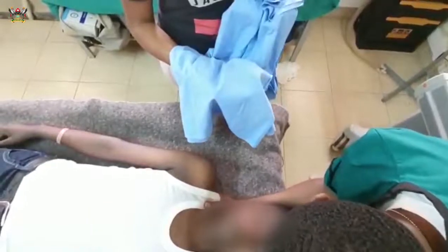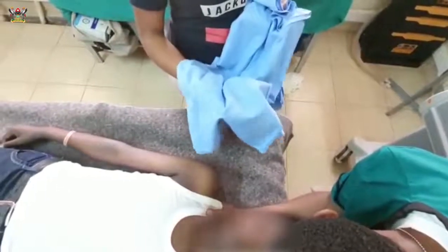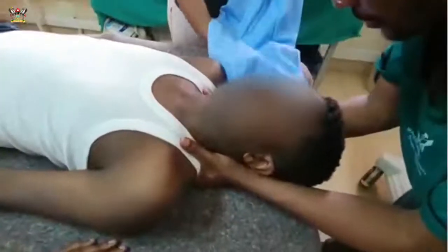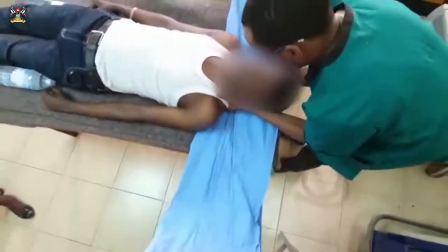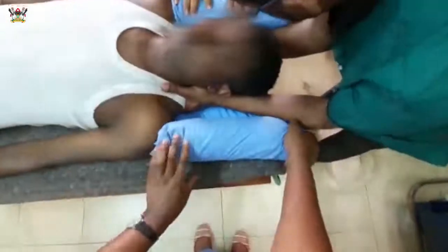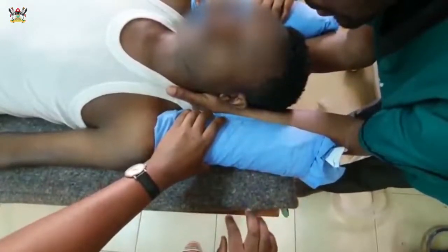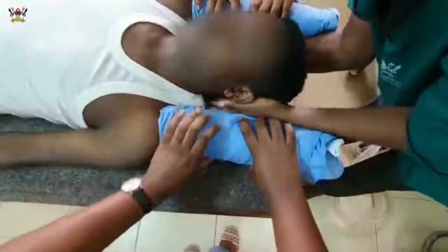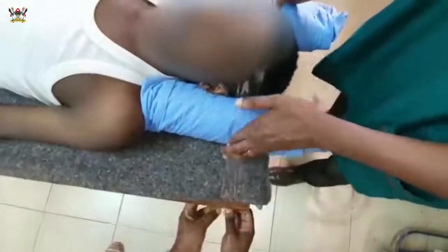I'm going to pass this bed sheet to the assistant while the other assistant helps stabilize the neck. On my count of three, you're going to lift the head so I can pass the bed sheet over — one, two, three, lift. We then roll the bottle within the bed sheet, making sure to put the bottom of the bottle towards the shoulder to avoid hurting the patient. Remove your left hand, remove your right hand. You can use tape to help hold the stabilization material in place.